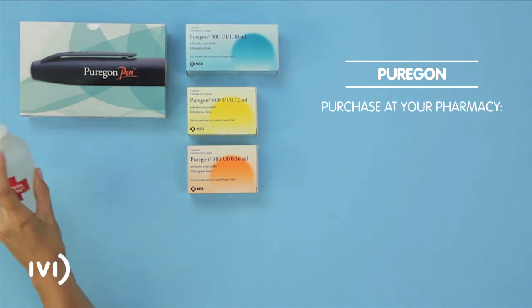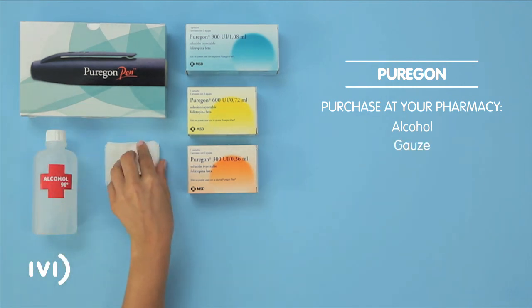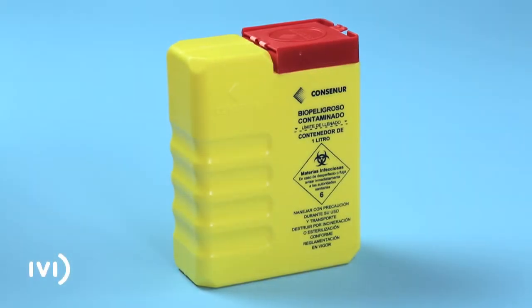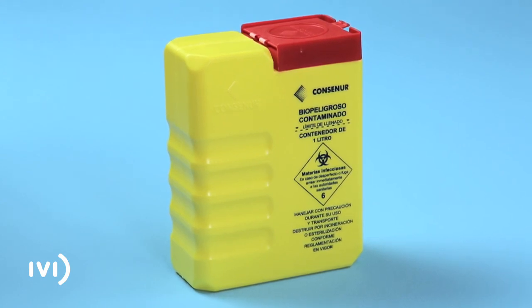At your pharmacy, buy alcohol and gauze. Use a suitable container for disposing of these materials after use or bring them to your nearest IVI clinic. Pay close attention to the following instructions and do not hesitate to get in touch with your IVI centre if you have any questions.